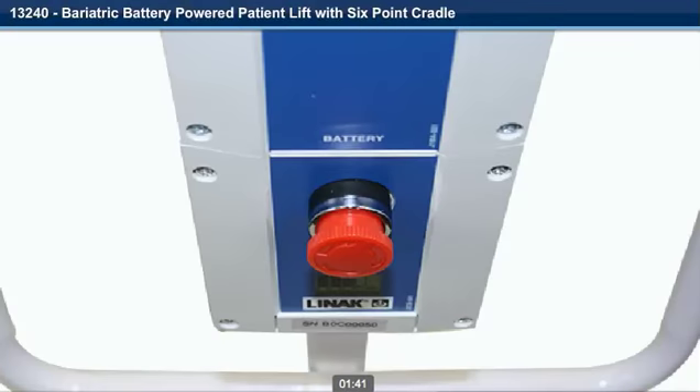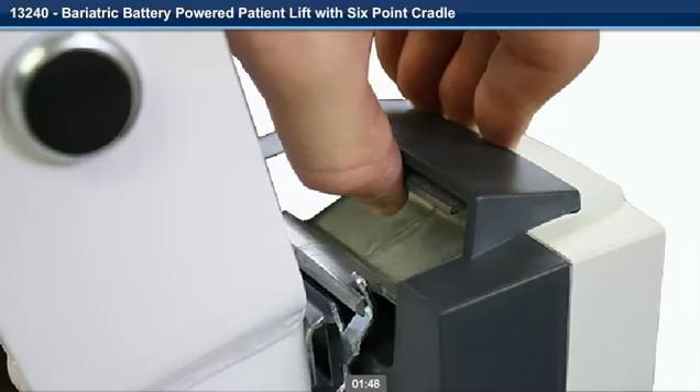Step 11. Line up the battery pack with the control box. Step 12. Pull up on the locking latch and release on the battery pack. Step 13. Push the battery pack over the upper bracket and release the locking latch to lock in place.